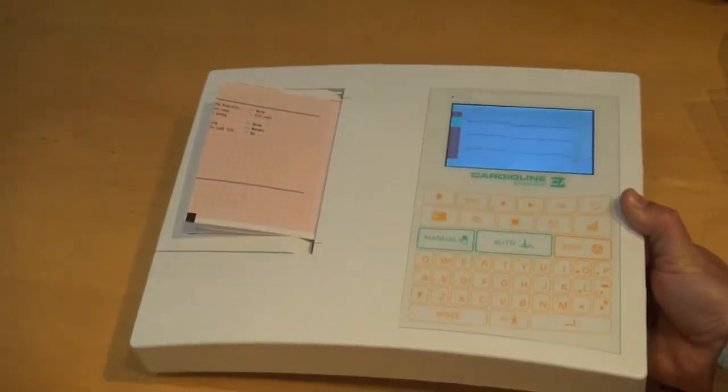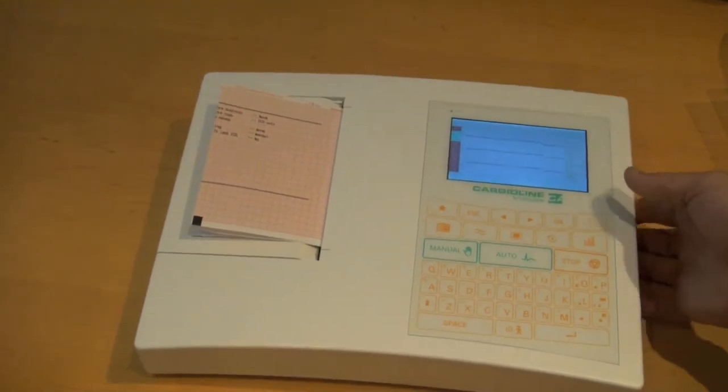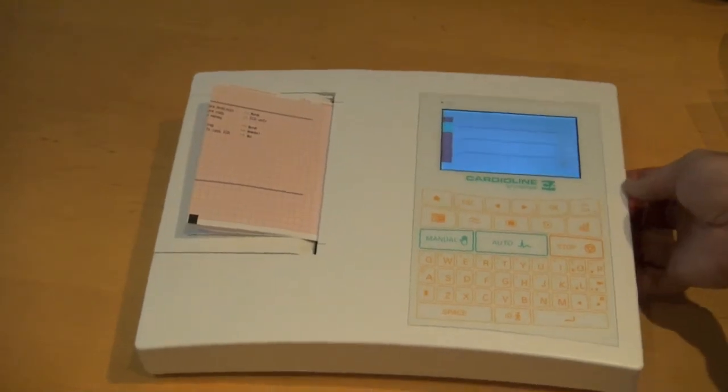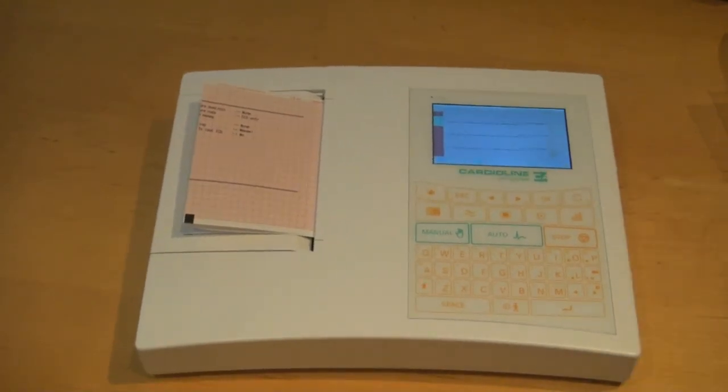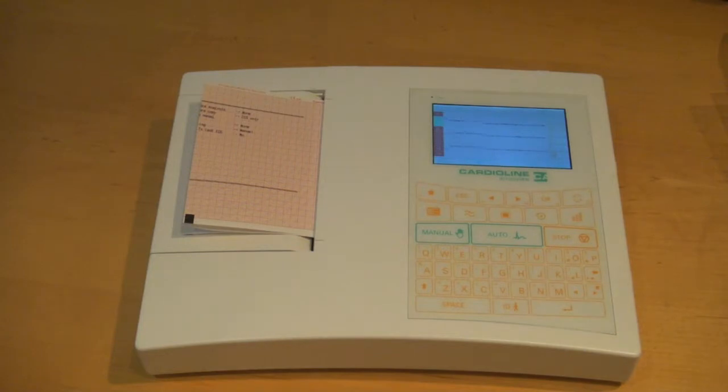So the AR-1200 sits in the middle of the Cardioline product line range as a six channel. There's the AR-600 below it and the AR-2100 above it.